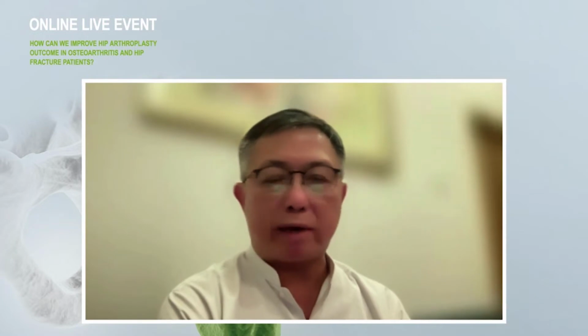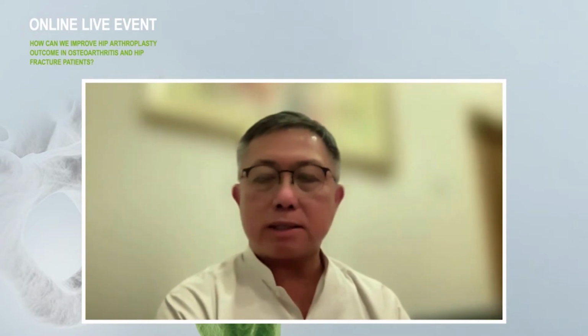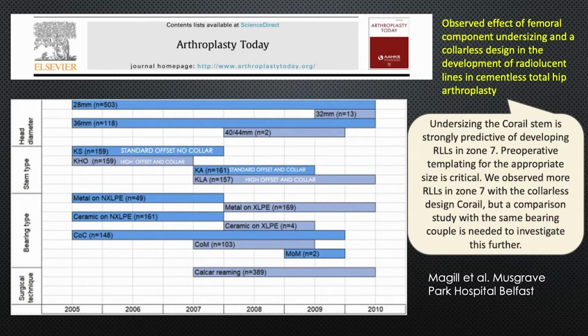And it really concerns what you do with patients with very, very bad osteoporotic bone. This tends to happen in patients with hip fractures. I'd like to go back to what Paul was saying. That slide really has to do with the presence or absence of a collar. This is in cementless implants. There was a paper from Meding and Ritter, and it basically said that in the long term it makes no difference whether you use the collar or not. I'm sorry, Paul, but that's what it says, and it's a very large registry type paper.